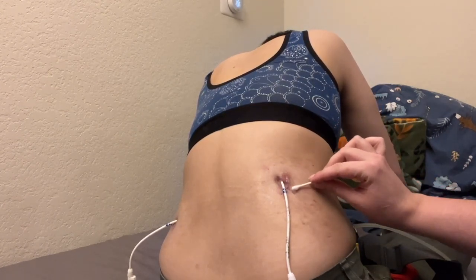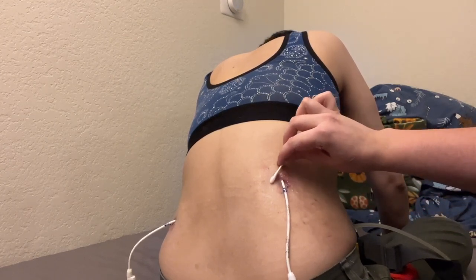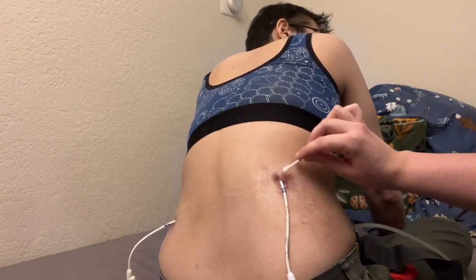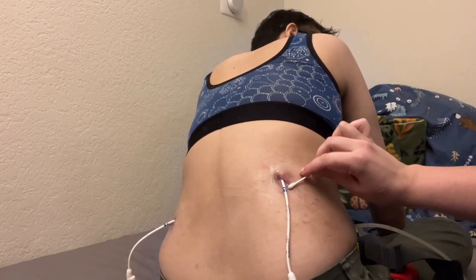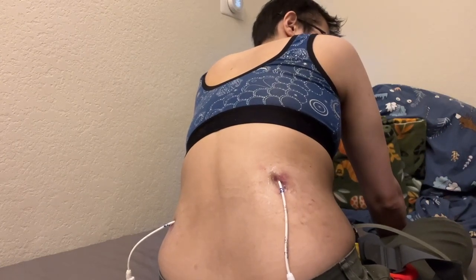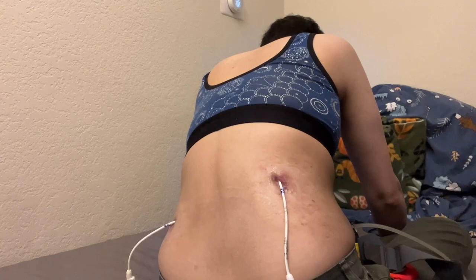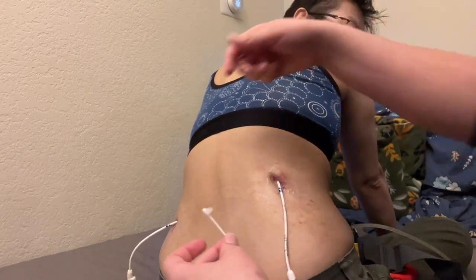I don't put it right on the stoma, but kind of around it. We don't want it to go inside the hole, but this is for keeping infections from getting in through the skin, hopefully. And I'm just using the other side of the q-tip for the other one.